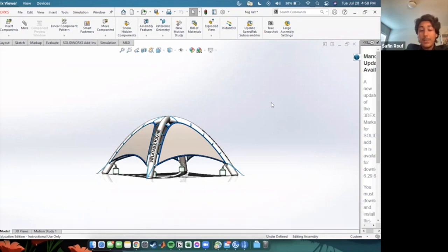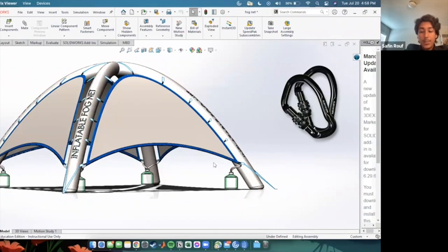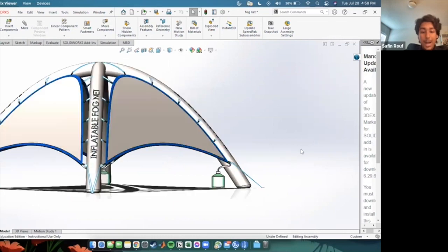Also, as we are focusing on meeting the needs of families in rural areas of Nigeria, we have tried to make our device as portable as possible. The main body of the tent is inflatable, so it can be easily transported back from primary healthcare facilities. A straw for blowing will also be provided. Once the main body of the tent is set up, the films can be attached using carabiner clips provided by us. This is both low cost and durable. After the mother enters the tent, she can place the child in their cot.